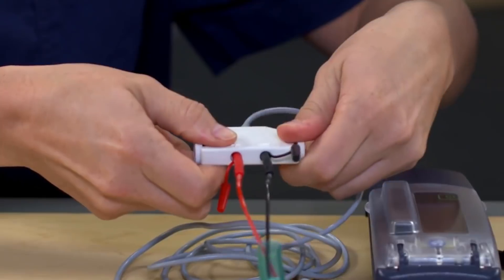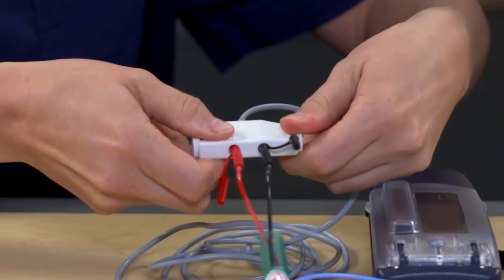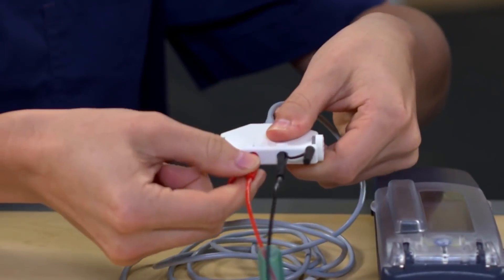Do I need a tool to make sure they're tight? No need for a tool — that could actually cause damage to the cable. Just tightening with your fingers is all that's needed. And when you're done, give a slight pull just to make sure they're secure. They're secure now.